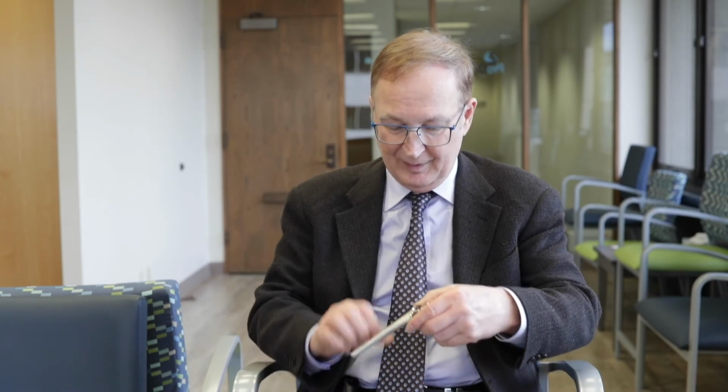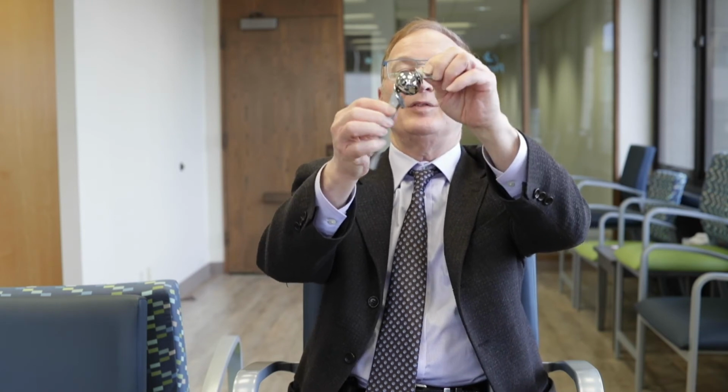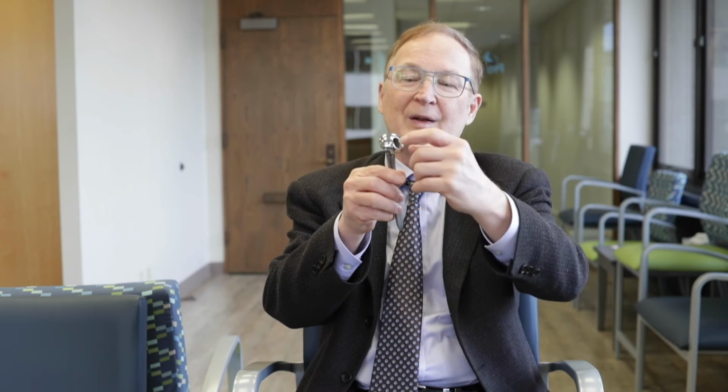He then tried implants that were very stout, the ball in between a socket piece and a stem piece. For a time, he made a hole in it and passed Gore-Tex as a little rope connecting the ball and the socket. Then he eventually concluded that none of those were the answer, and just a regular shoulder implant with a standard plastic socket and a ball was the way to go.